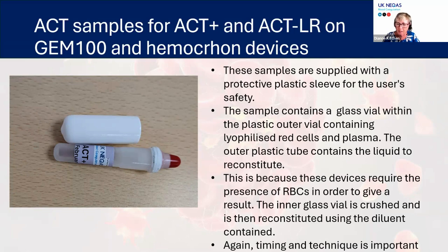So you break the inner glass vial, which mixes the two, the liquid and the lyophilized red cells and plasma, and then test. Again, timing and technique are important.